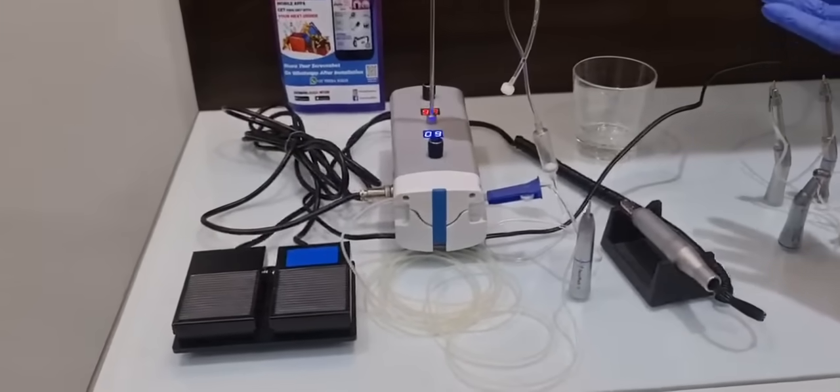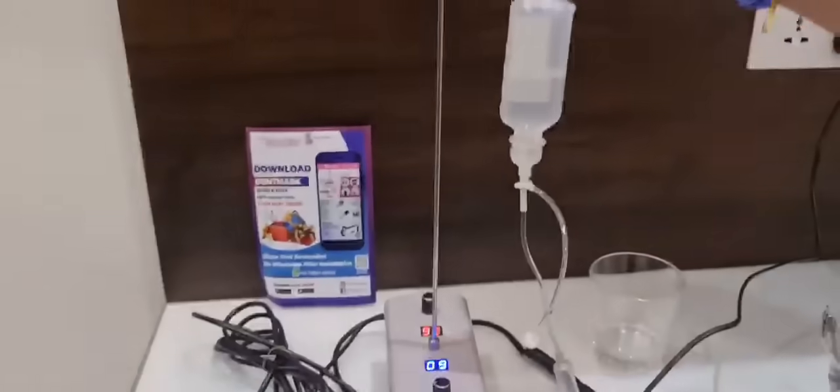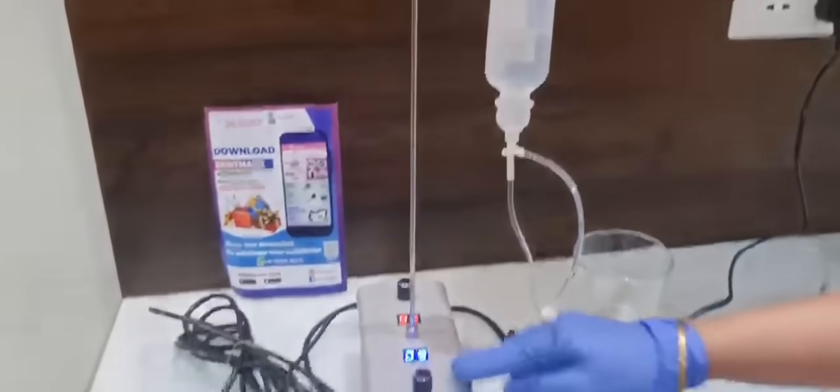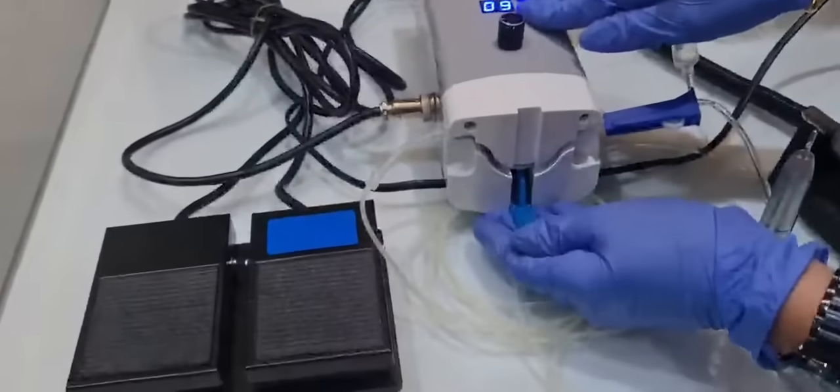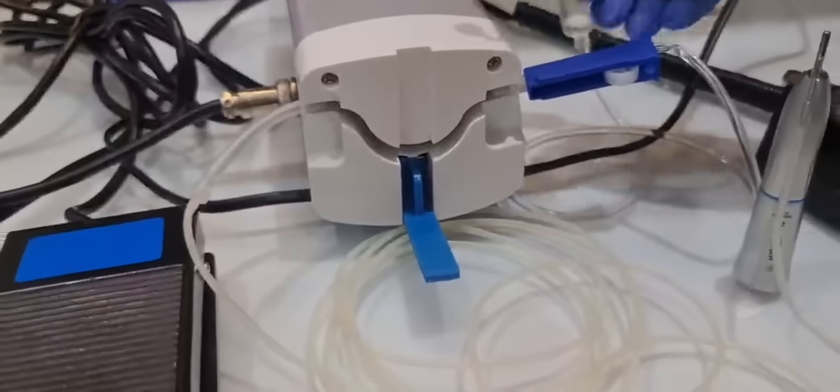Now let's go ahead and see the actual working of this surgical brushless E-type motor. You can see that the saline water is attached to it. This is the place where you are going to attach the tubing of the saline water.